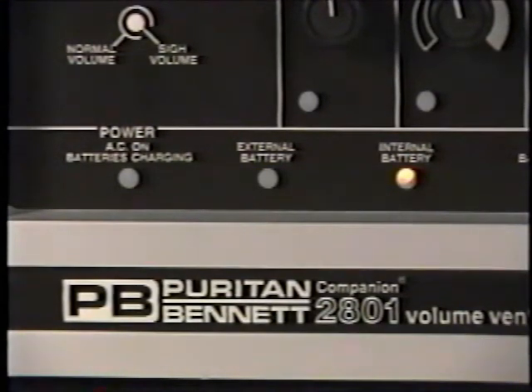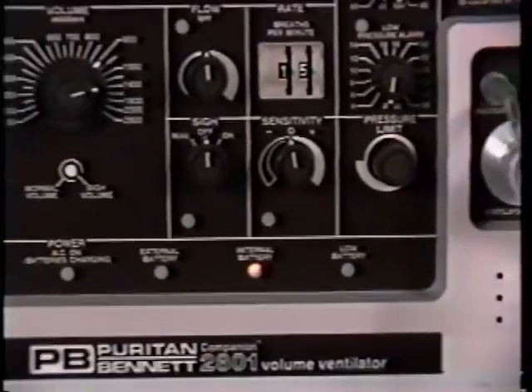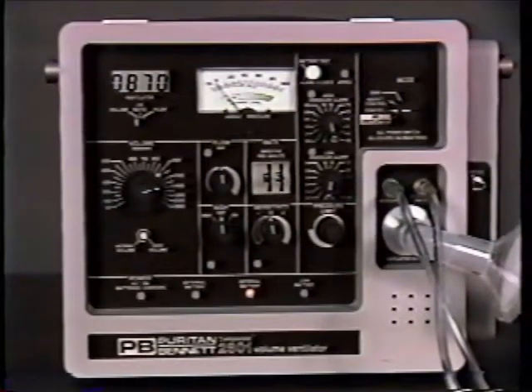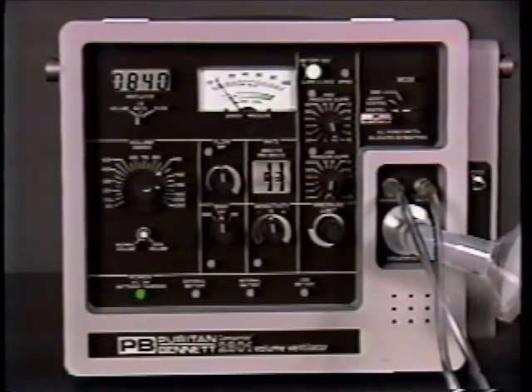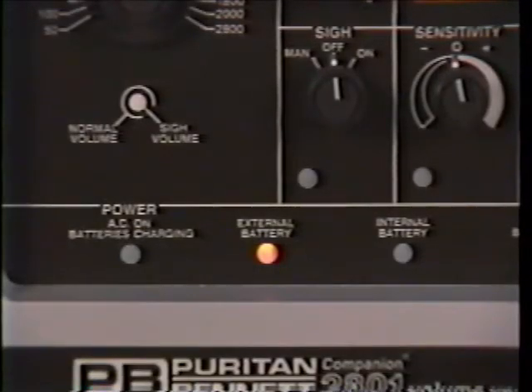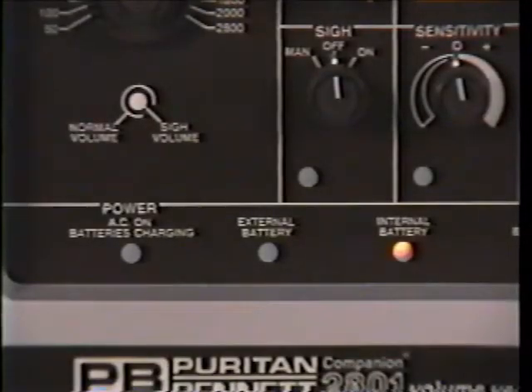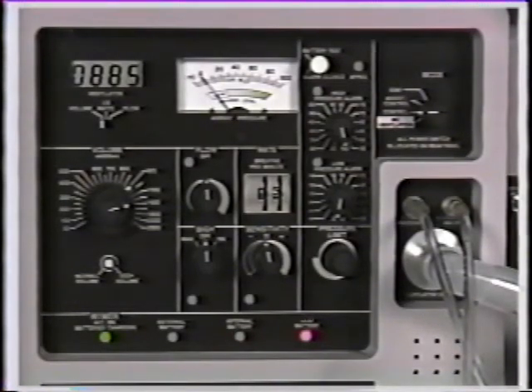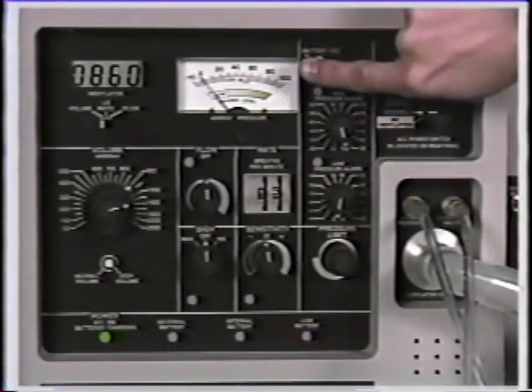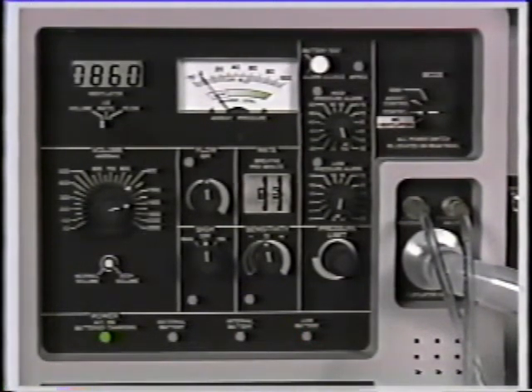When the Companion 2801 is being powered by the internal battery, a short audible alarm will sound every 4 minutes. If AC power is restored, the ventilator will automatically switch to AC power and the green AC indicator will light and the ventilator will begin charging the internal battery. When the Companion 2801 is powered by an external battery or its internal battery, the low battery alarm will sound, and the low battery indicator will light when the battery in use becomes low. Whenever a low battery alarm is activated, immediately connect the Companion 2801 to an AC outlet.